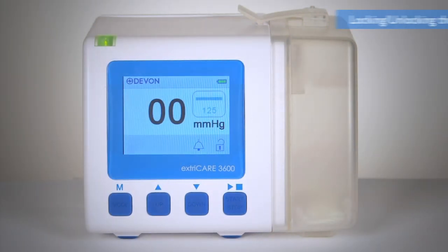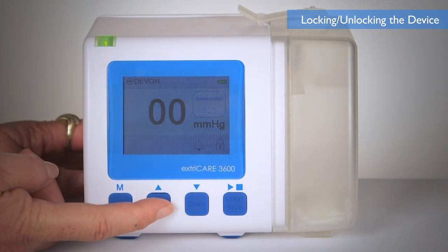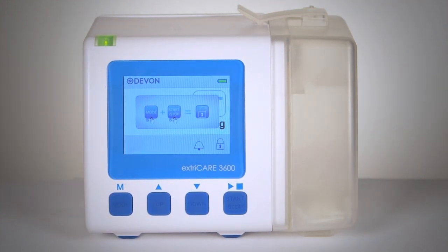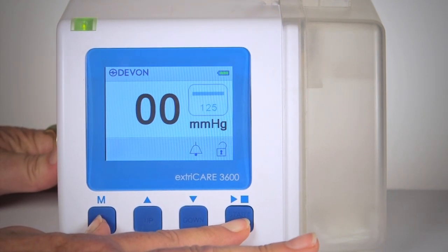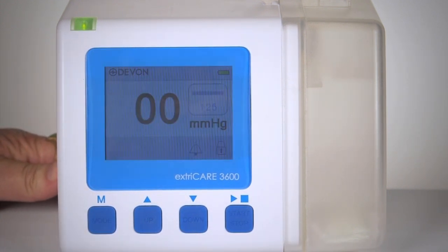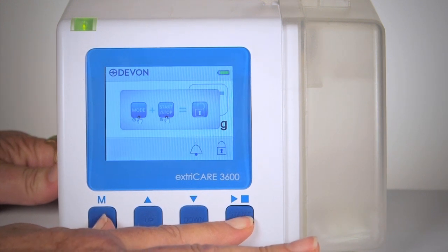The ExtraCare 3600 pump will automatically lock if the device is inactive for 3 minutes. If this occurs, pressing the buttons will illuminate the screen, but the settings will not change. To manually lock the device, press and hold the mode and start-stop buttons for 2 seconds. To unlock the device, press and hold the mode and start-stop buttons for 2 seconds.